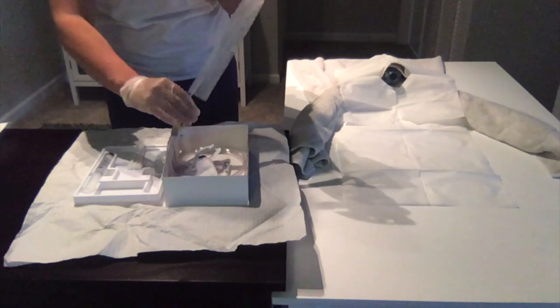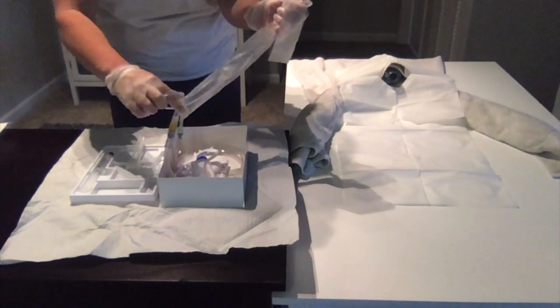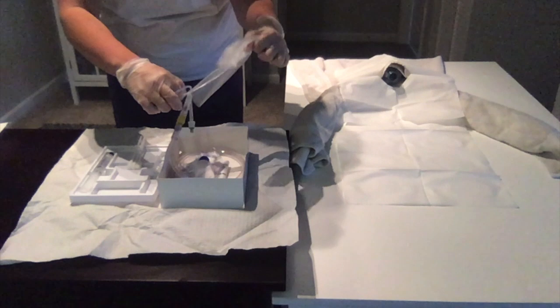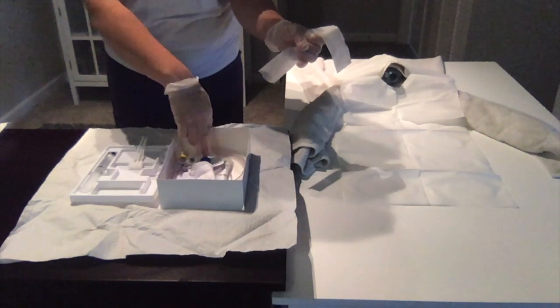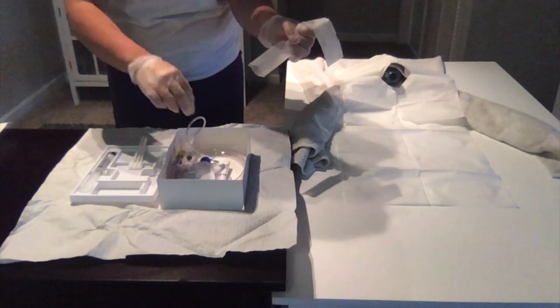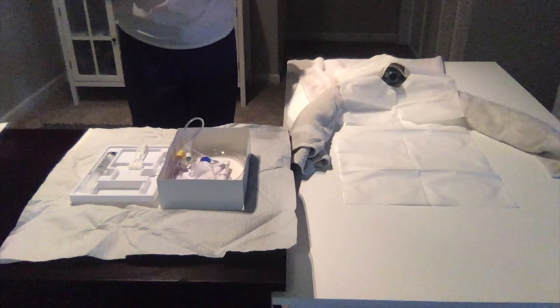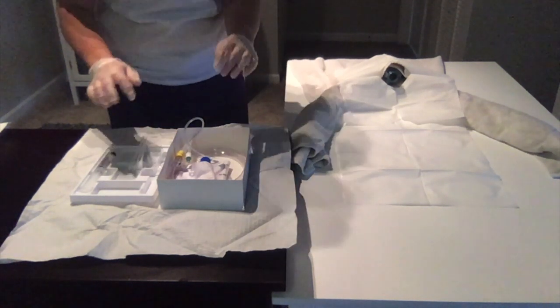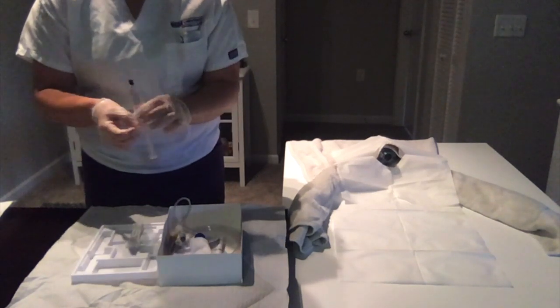I can pull this off, but I'm just curling this in my hands so it doesn't all spring out on me. And I can place it back inside the box. Okay, and I'm going to drop this again at waist level to maintain my sterile space. So after I've taken this out, I can go ahead and put this on here.